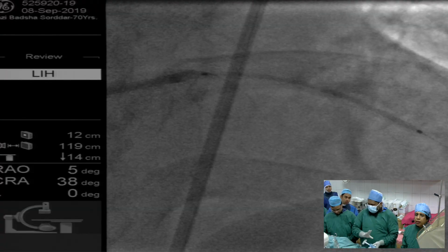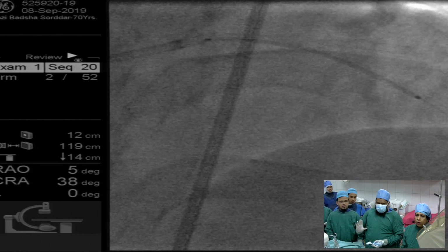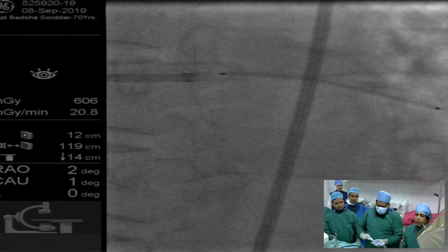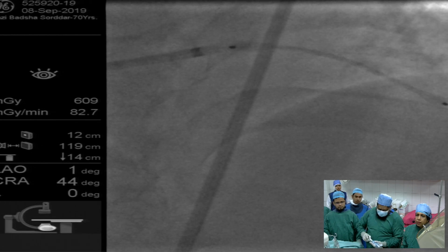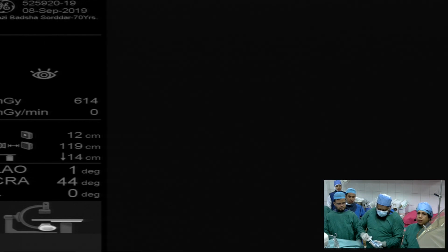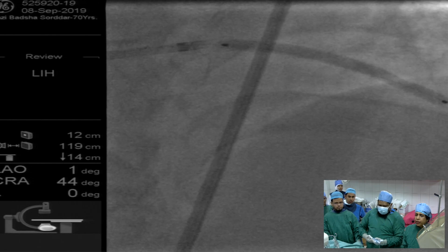Yeah. So we've covered. Have we covered the ostia? Just falling short of the ostia, right? Yeah, because the ostia was. Okay, yeah. Position. Yes. 2, 4, 6, 7, 8, 9. The nominal pressure is 9, right? So we can come down again.